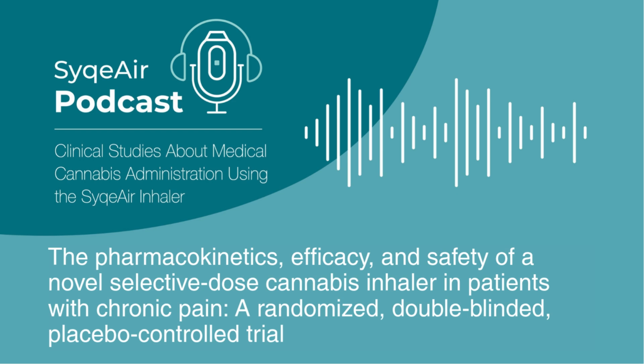Okay, so we have a device designed for consistent, uniform, metered low dosing. How do they actually test its effects in patients? Right. The study design was pretty robust. A randomized, 3-arm, double-blinded, placebo-controlled crossover trial. Okay, let's break that down. Randomized, double-blind, placebo-controlled. That's the gold standard. Crossover means each patient acts as their own control. Exactly. Each patient experienced all 3 conditions.